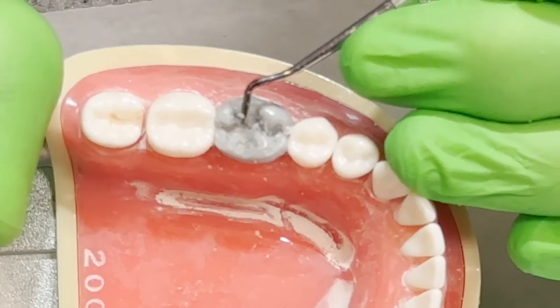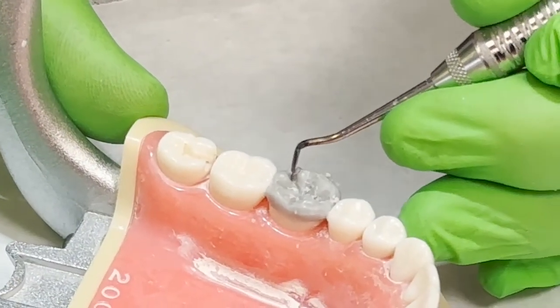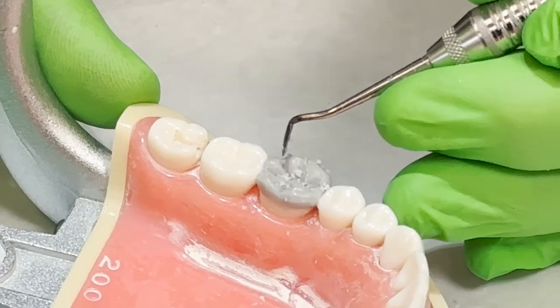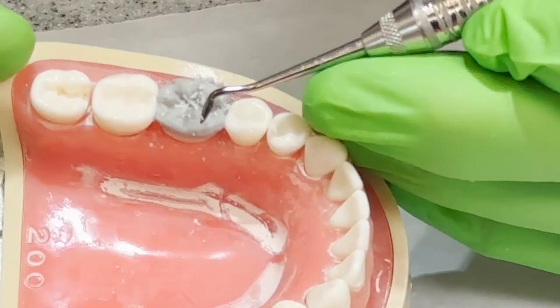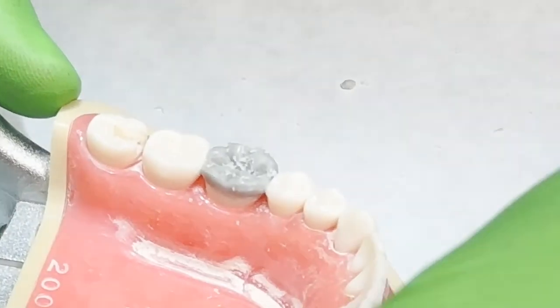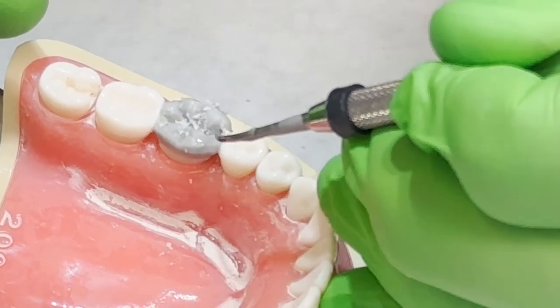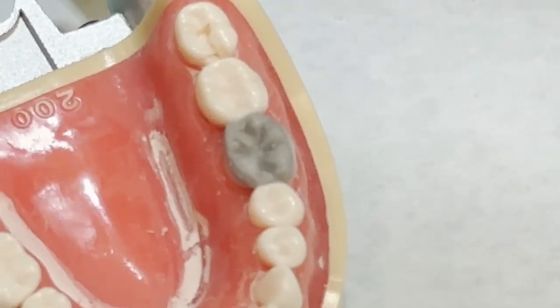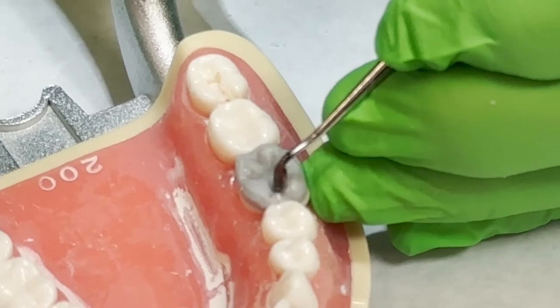Dr. Vernon, if you want to say anything about what you're doing, you're still filming. Yeah. So just basically checking the anatomy on everything and kind of adding where I see it's lacking, and blending it in. You see that okay? Does it start to look like a tooth? Yeah, it looks really nice.